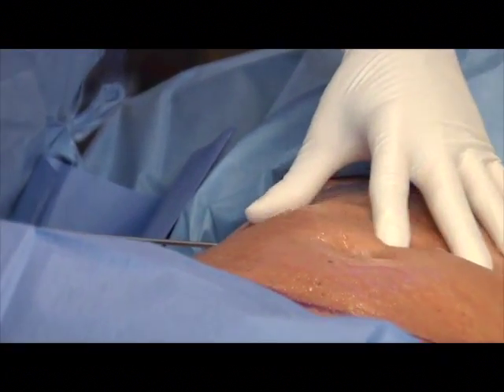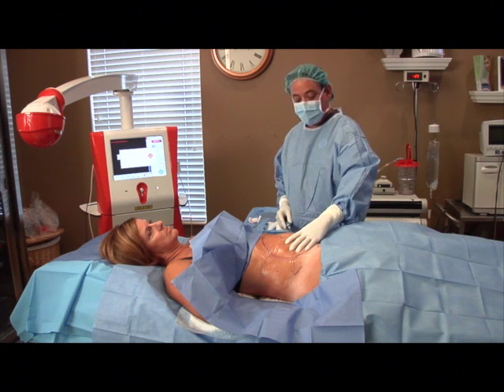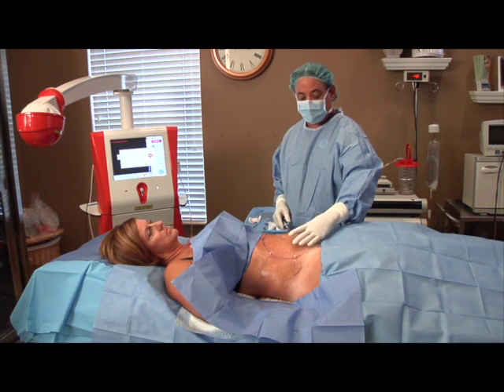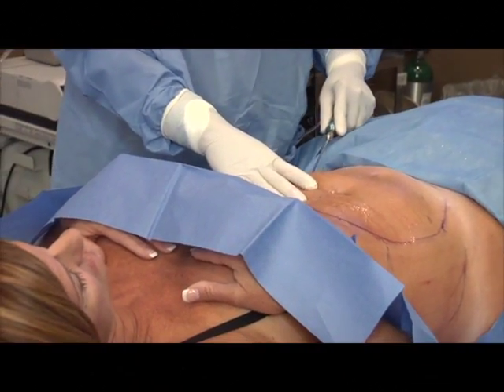So you're going to feel a little uncomfortable as this fluid goes in your abdomen. This is lidocaine to numb the tissue. How you doing there? Hi.